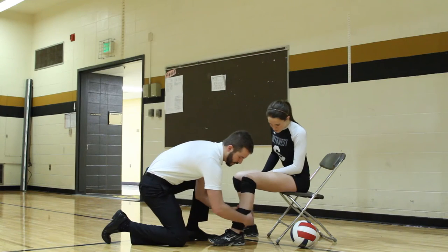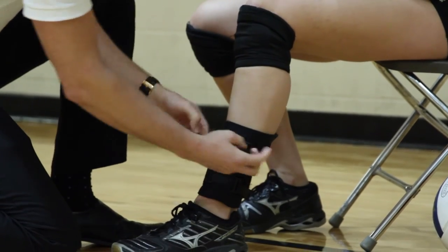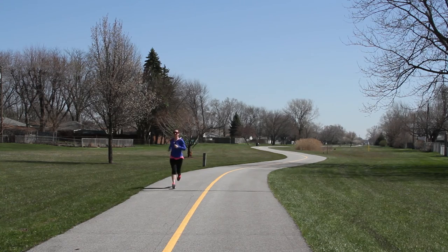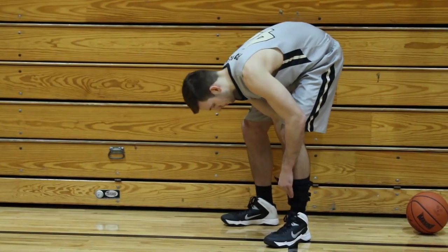Pain is the one contributing factor that keeps us from doing something, whether it's an ankle injury or something else in our body. From the patients and from the experiences I've had working with them and introducing my brace to them — being able to take away their pain — it's something that brightens their day. It brightens the way they feel about themselves, because if you can take away something that's prohibiting them from doing something they enjoy, you're giving enjoyment back to someone who didn't think they could use their ankle or walk normally because it hurts.